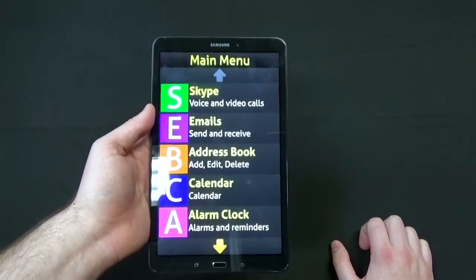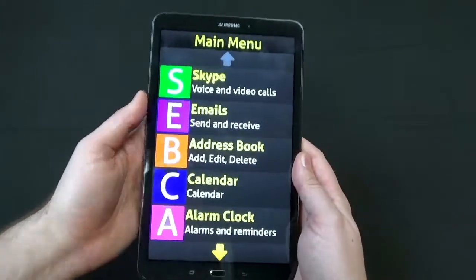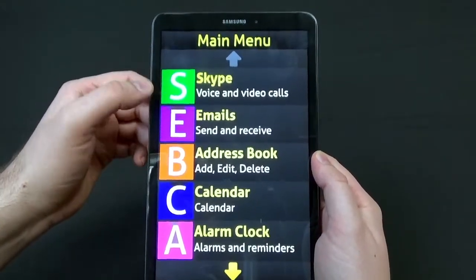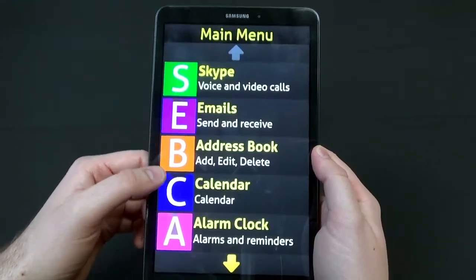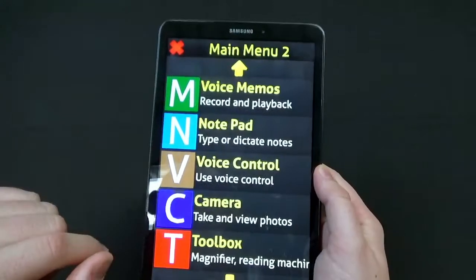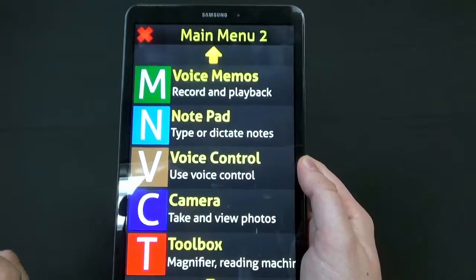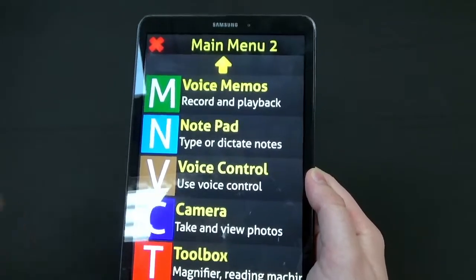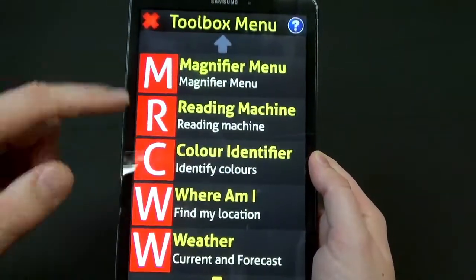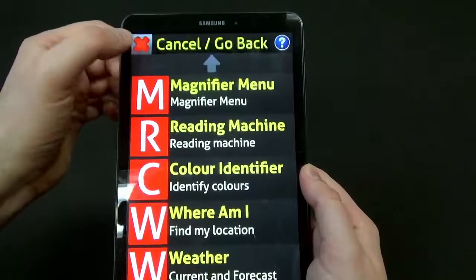As you can see, it's made everything really nice large print, high contrast or colorful, and it's simplified the user interface quite significantly. In the main menu you have Skype for making and receiving calls or video calls, email, address book for managing contacts, calendar for scheduling, alarm clock for setting alarms, voice memo, a notepad for taking notes, voice control, a camera, and a toolbox. Inside the toolbox you can find things like your magnifier, OCR reader, a color identifier, weather, and more.